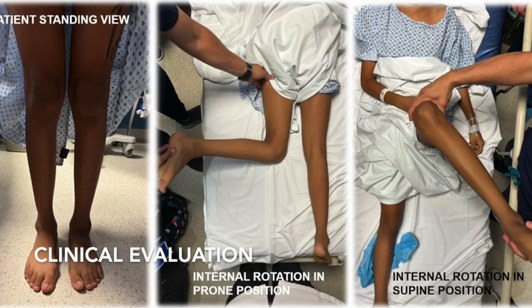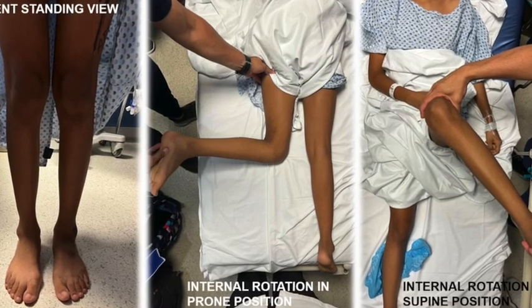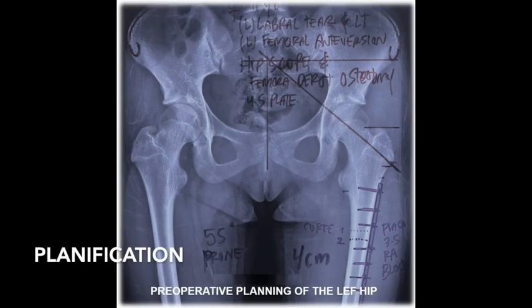Next, clinical evaluation is performed, with the patient standing and in prone and supine position. Note the increased internal rotation in the middle image, which is in the prone position. In this particular patient, a hip scope was planned followed by a proximal femoral derotational osteotomy due to increased femoral anteversion. The preoperative planification is shown.